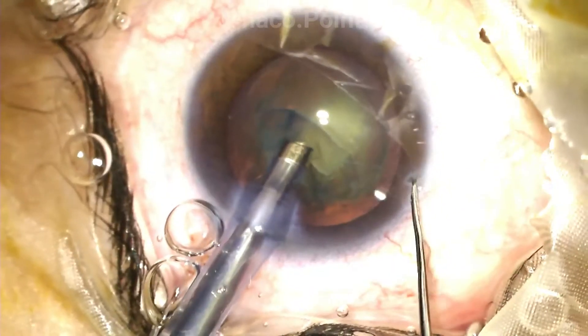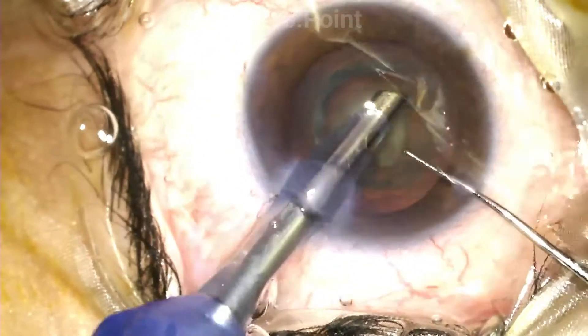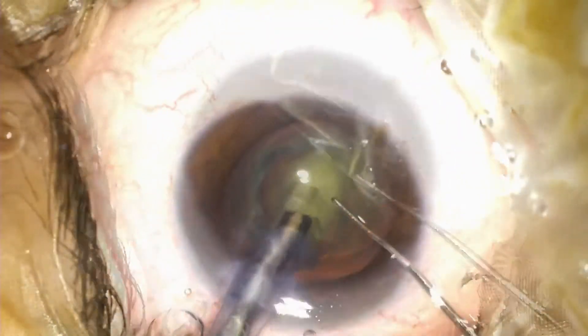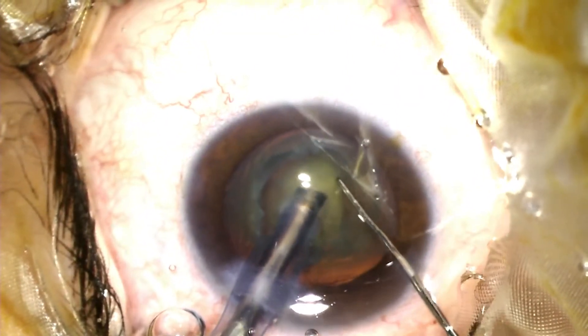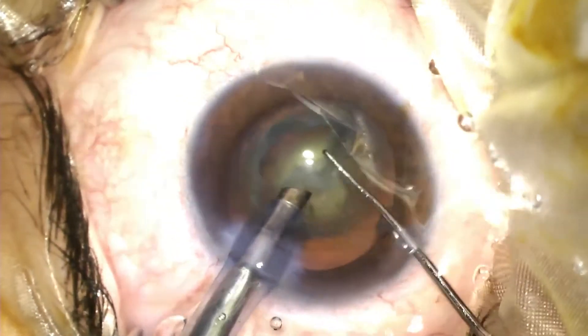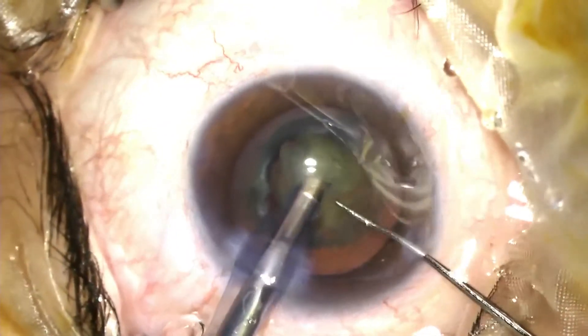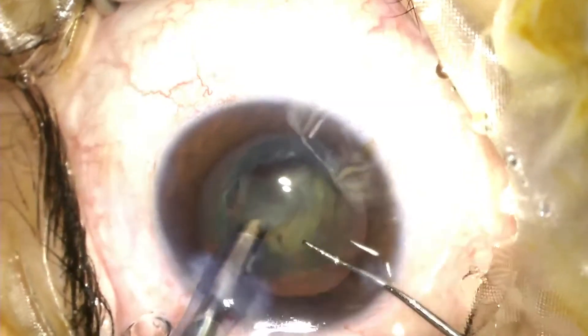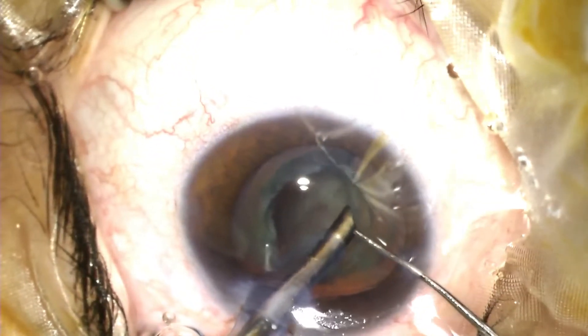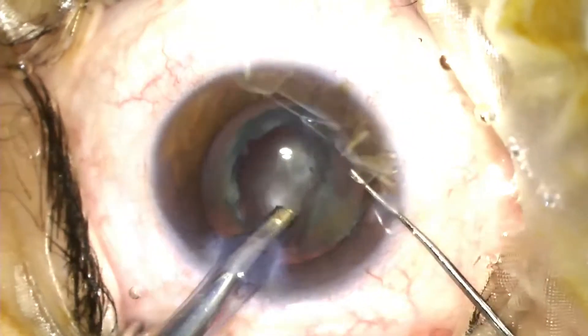We now move to the nucleus management. The principles of nucleus management in a polar cataract are: one, you work with low flow settings, and the technique being performed is that of a direct chop with lateral separation in situ. In this particular case, I've ended up doing a primary chop and both halves of the endonucleus are removed out of the bag and emulsified.